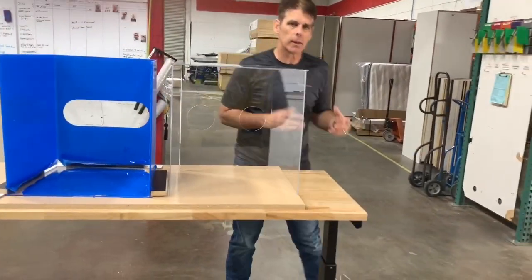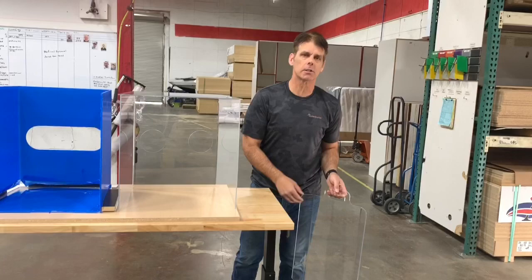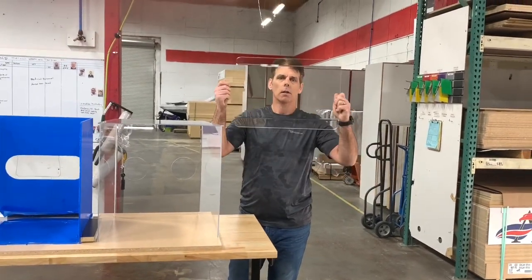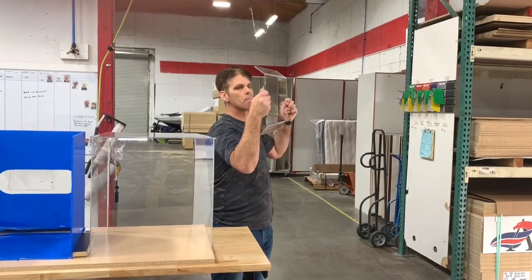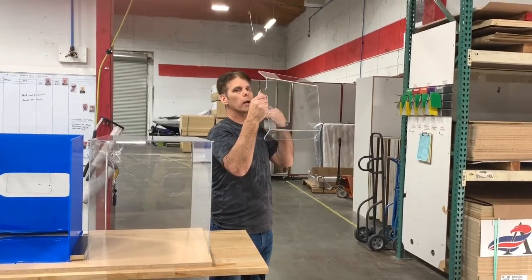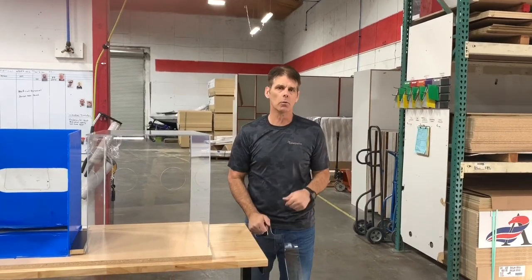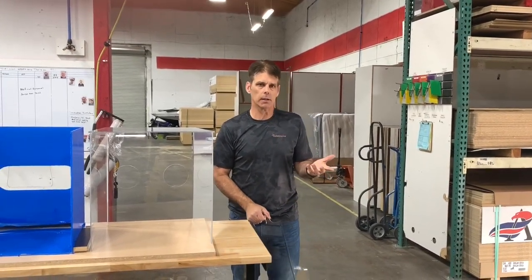Additionally, we can do other things. If you need something, let us know what you need. This is one that we thought of — this is just a handheld shield that if you're working with a patient, that patient can hold it up while you're doing an examination, and when they're done they can set it down. Just one more barrier between you and the patients out there.